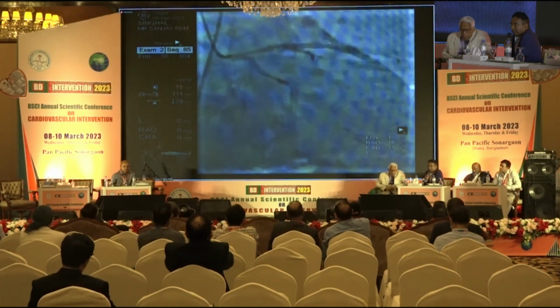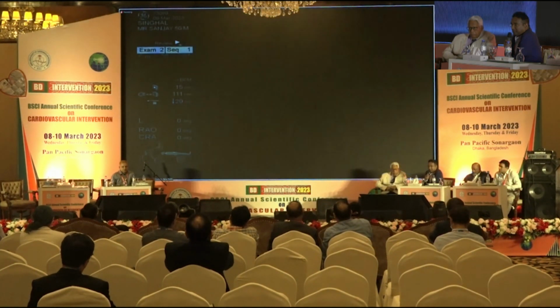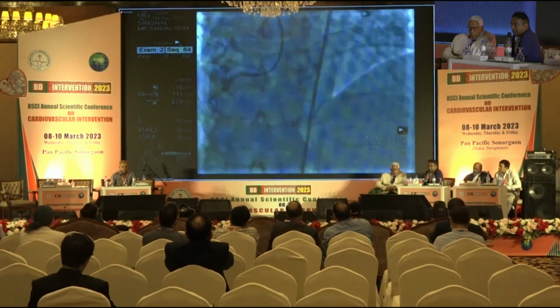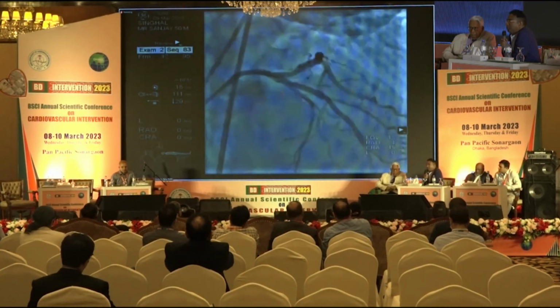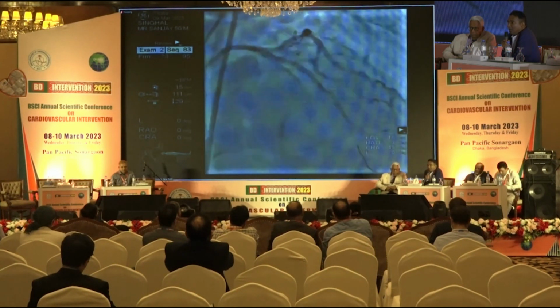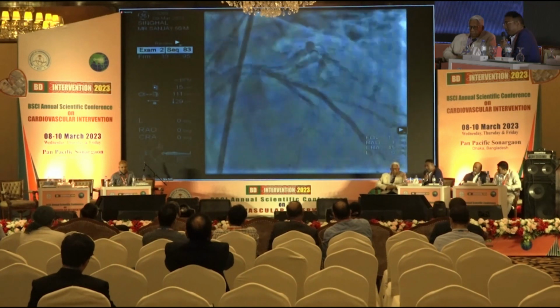It's around 50% still, no trauma to it. And you saw it anyway in the previous, and there was enough contrast. Sir, just wanted to show, initially your strategy was fixed to provisional stenting. What are the factors that influenced you to go to the kissing balloon for both D1 and the septal?